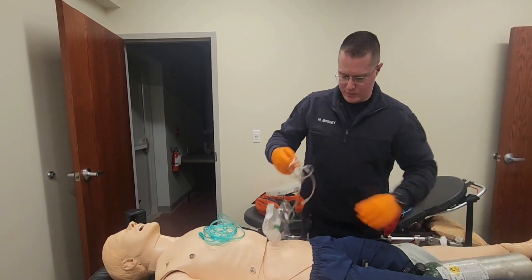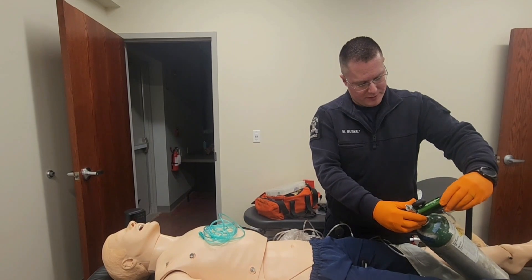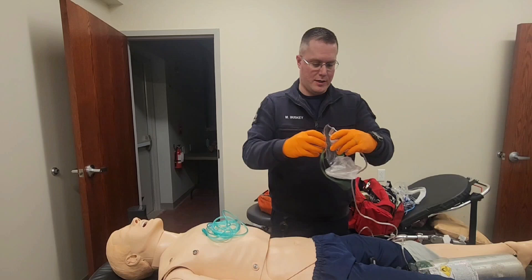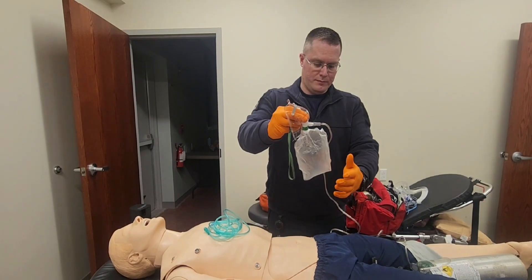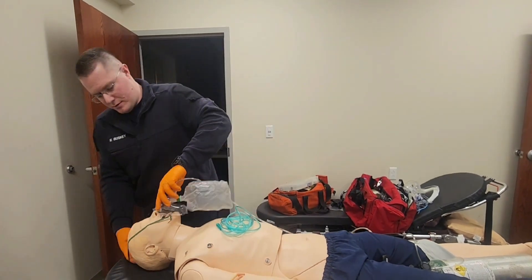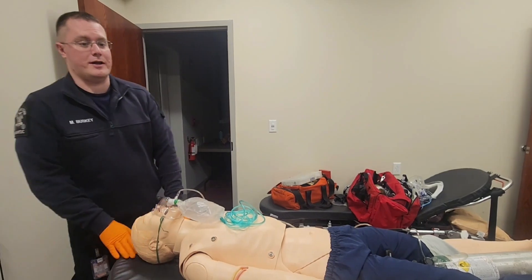I'm then going to attach my non-rebreather mask. I'm going to turn this on to 15 liters per minute. I'm going to pre-fill my reservoir by putting my finger over the bag. It is pre-filled. I'm going to apply it to the patient, making sure the nose piece is tight and both sides are tight. It is fine.